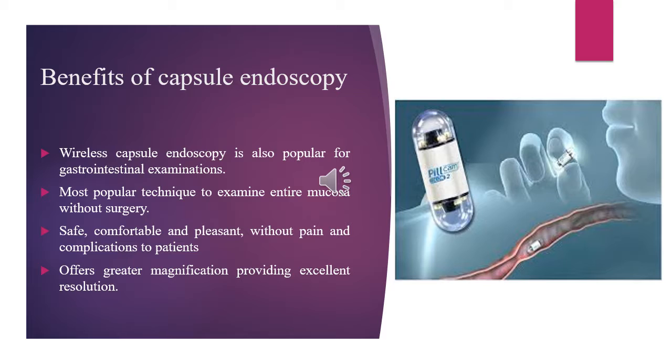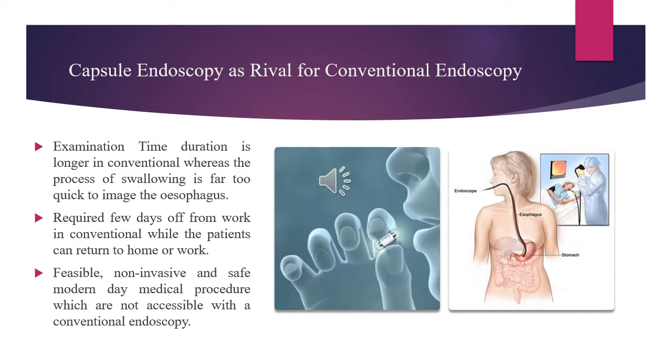It is also a safe and effective measure to view the colonic mucosa without requiring sedation. It is a good alternative for those patients who are reluctant to undergo conventional endoscopy. Capsule endoscopy also offers greater magnification, providing excellent resolution. Capsule endoscopy is a rival for conventional endoscopy.